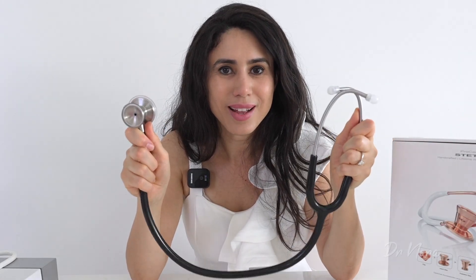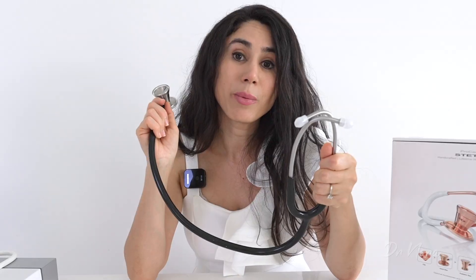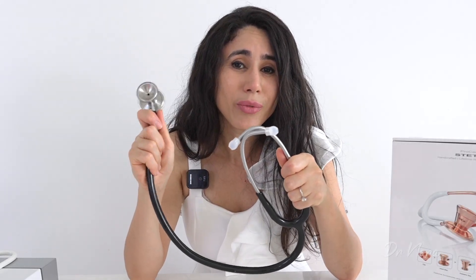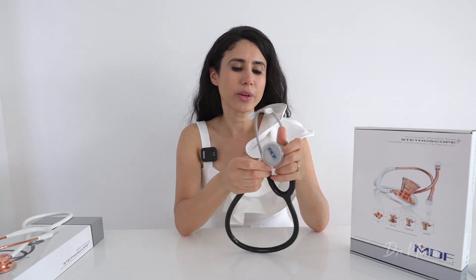Now it's the moment you've all been waiting for — hearing how this sounds on the heart. My first experiment is to let you listen to the heart sounds with the Procardial, and in a follow-up video I'll compare the Procardial versus the Littmann Cardiology and versus the Littmann Classic 3. First up, I'm activating the diaphragm — this large flat area — which is designed to pick up high-frequency sounds.